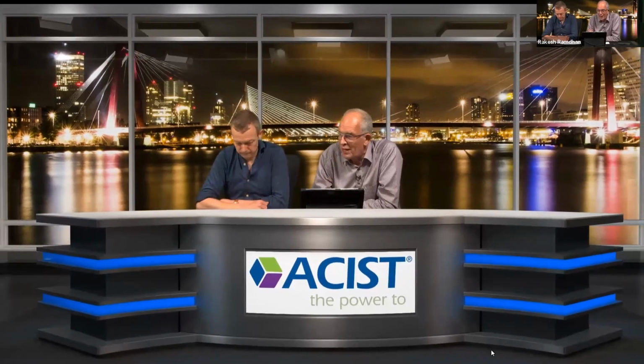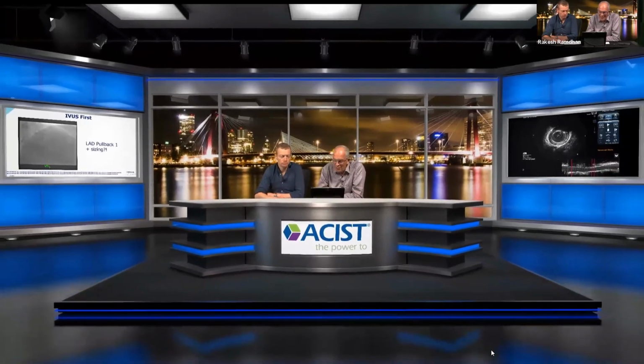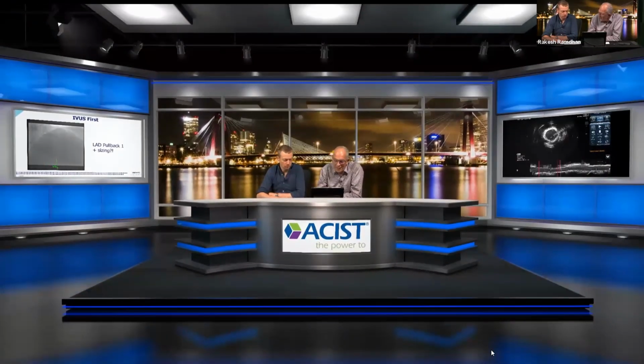And of course you can have situations in a diabetic patient where you have plaque burden everywhere. Absolutely. And then you have to choose. You define, because you're the doctor, you know what your patient needs, and then you define your acceptable lumen. The world is not always ideal, but in this case I think, well, big steps quickly at home. Okay, good.